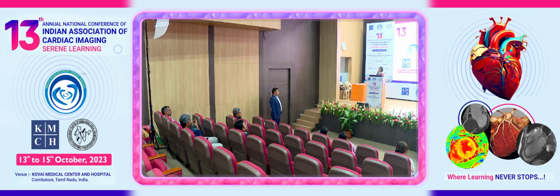This is something that we see in a few patients, where suddenly in the distal LAD there is some... It means to us that there is ischemia, but on CT coronary angiogram we cannot see a lesion. Whether it is microvascular obstruction, we don't know what the cause is. But that particular lesion is not causing significant stenosis, so we go back and check to make sure that there is no lesion proximal to it.